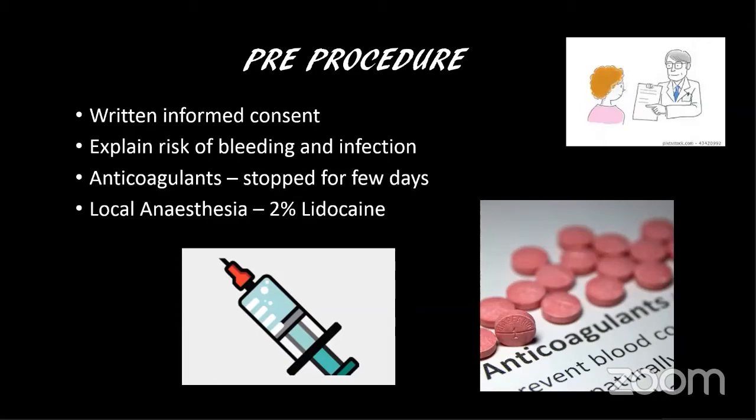We can always give a few minutes of more compression to stop the bleeding if at all it occurs. But if she is on anticoagulants for some other cause like DVT, then you may stop it in consultation with the clinician who is treating her, or get a PT-INR done a day before the procedure to see whether her bleeding profile is normal. Then all these procedures are performed under local anesthesia, which is 2% lidocaine.